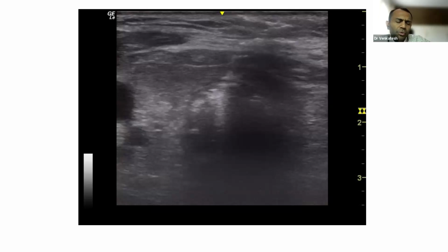Generally, make sure that the patient's head is near the head end so that the person standing at the head end is also comfortable. And the patient is preferably slightly towards the right of the bed. If you are a right-hander, naturally you will be standing on the right-hand side of the patient. And the ultrasound machine should be on the opposite side so that you are easily seeing the ultrasound machine. And we get a nice ultrasound probe sheet, which we always utilize.